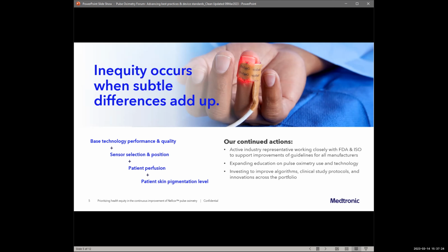So more work, we understand, certainly needs to be done, and we continue to stand by our partnerships, collaborating with FDA, ISO, Open Oximetry, and clinicians, further understanding all these confounding variables to SpO2 accuracy and fostering health equity by improving standards for development of pulse oximeters. And really, this is what we've been talking about today: the base technology performance of the oximeters, sensor selection and position, patient perfusion, and patient skin pigmentation levels. And we all are invested in improving our algorithms and clinical innovations across the portfolio.